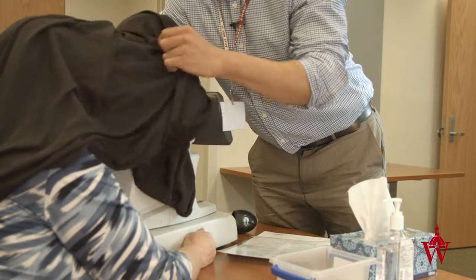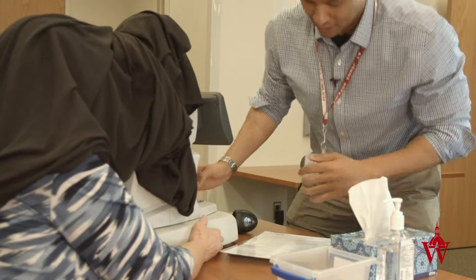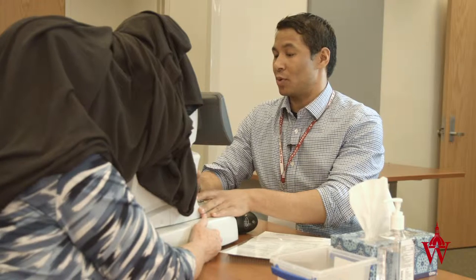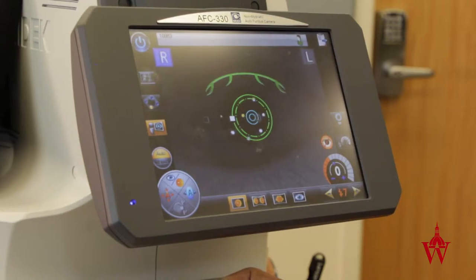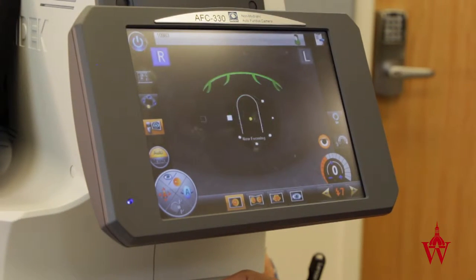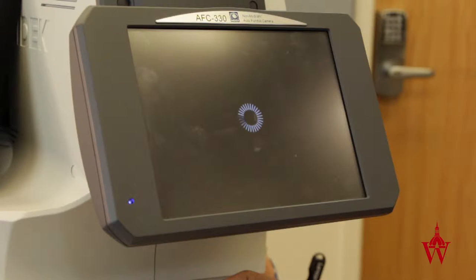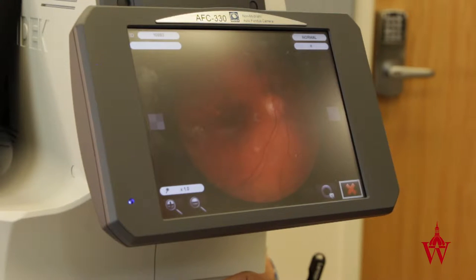Please let me know if that's uncomfortable for you. I'm just going to bring this camera in closer and focus. I just want you to focus on the green light. You're going to see a bright flash.